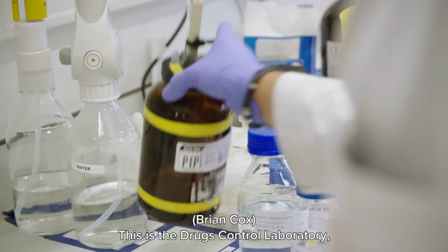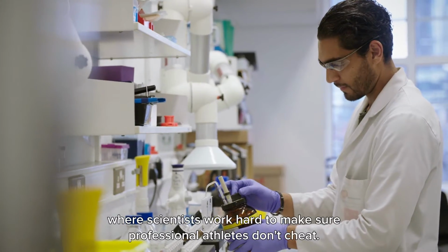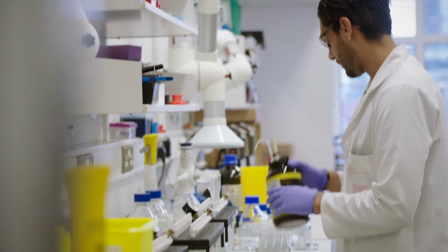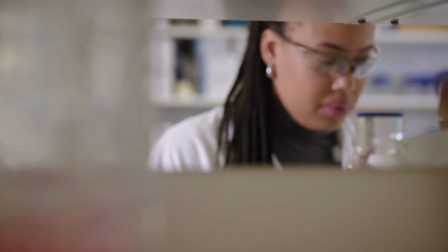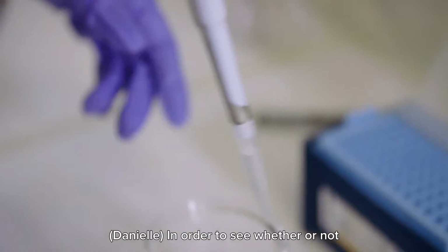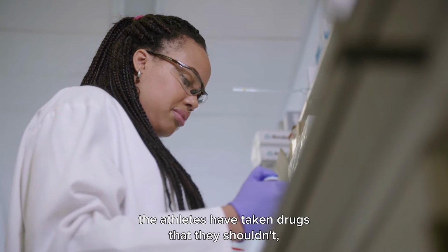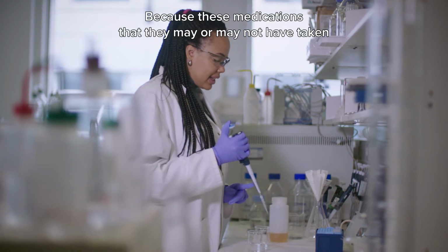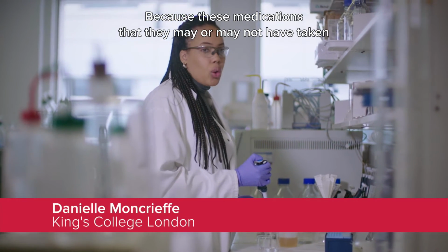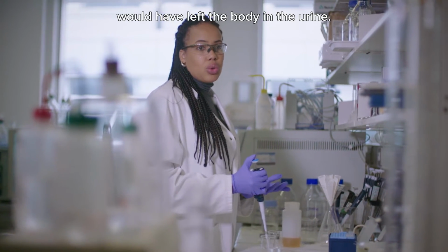This is the Drugs Control Laboratory, where scientists work hard to make sure professional athletes don't cheat. And they do that by using a special separation technique. In order to see whether or not the athletes have taken drugs that they shouldn't, we test their urine, because these medications that they may or may not have taken would have left the body in the urine.